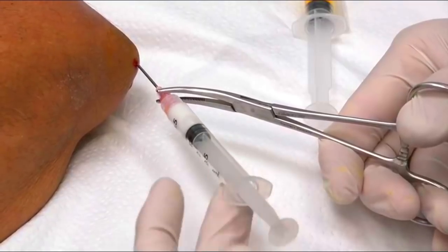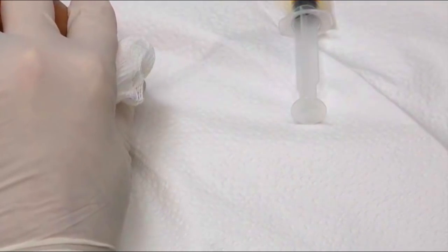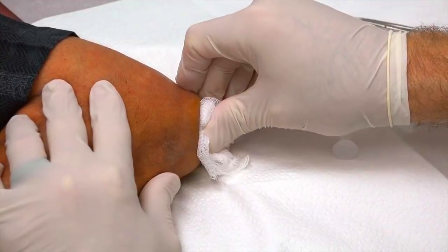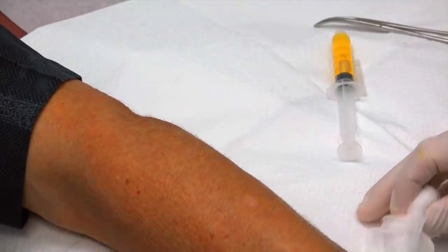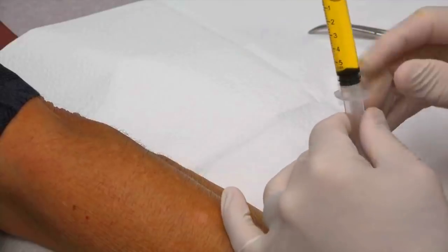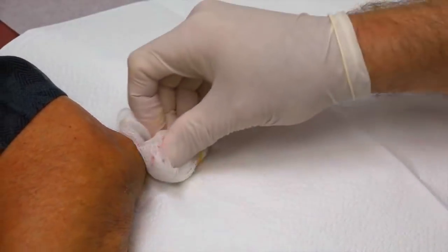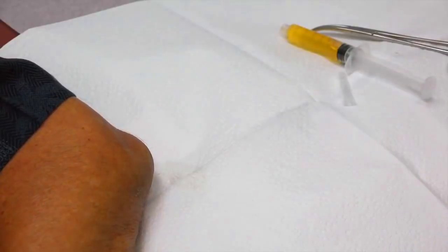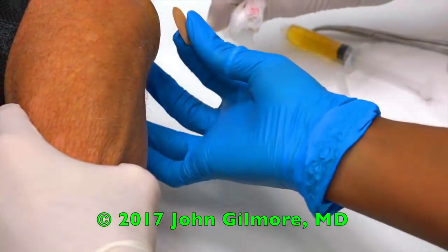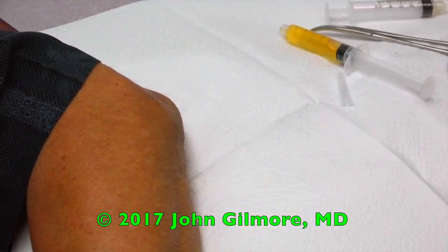There we go. So we got the vast majority of the fluid out — you can never get a hundred percent of the fluid out, but that's what it looks like. That should be a little more comfortable for you. We're gonna put a little dressing on this. Hopefully it won't bleed much. About five cc's, about five ml. We'll get a bandage on — okay, lift up a little bit. There we go. All right, Woodsy, you're all set!